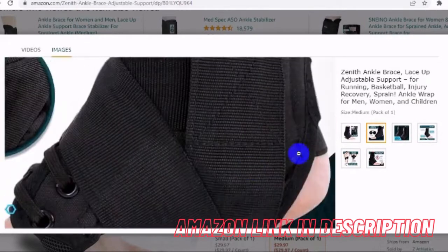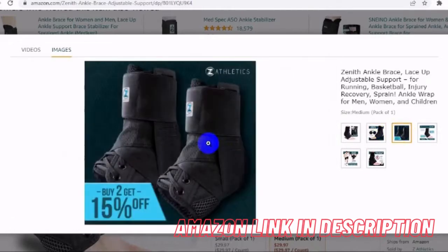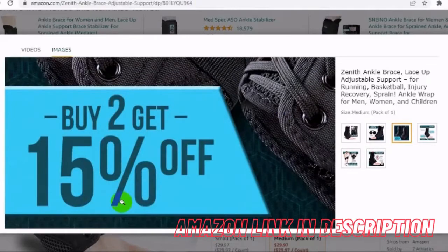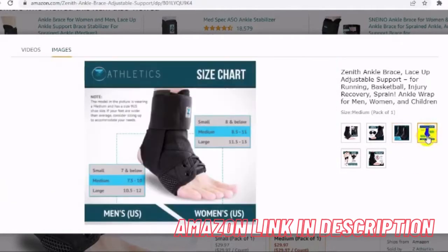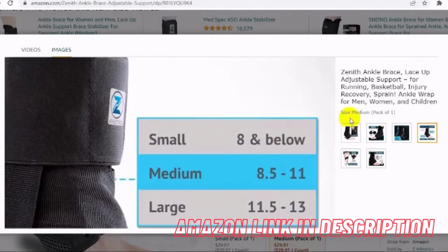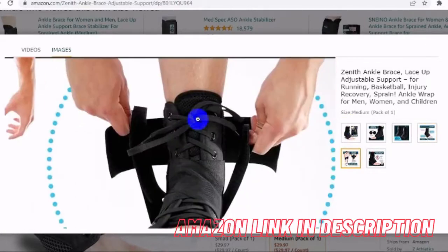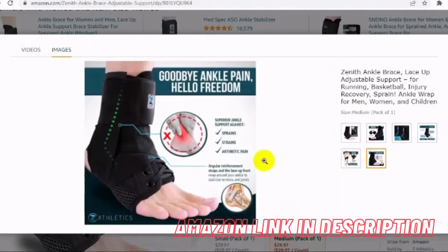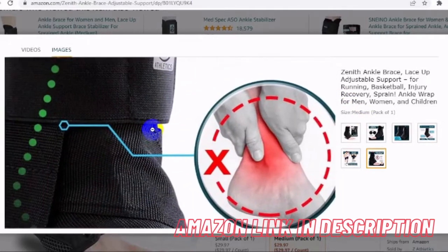Ankle pain be gone: proven to reduce or eliminate ankle pain caused by sprains, tendinitis and other acute injuries. Our brace is designed to be used for healing and prevention of sports related injuries as well as minor accidents. The side straps contour your ankle to immobilize the foot without restricting your ability to walk or run.